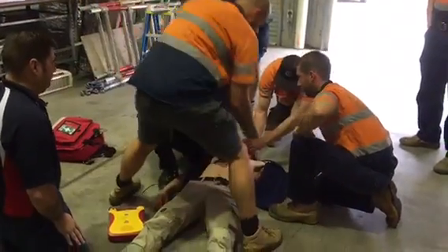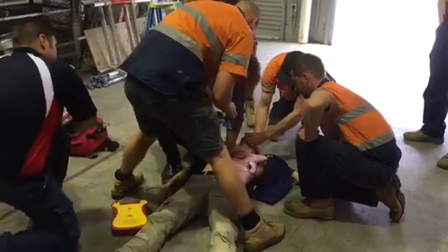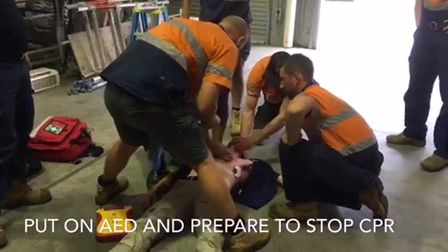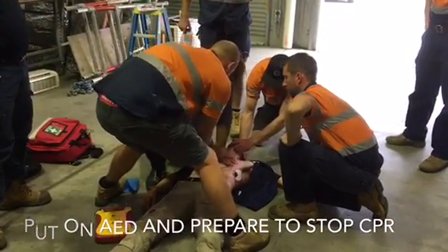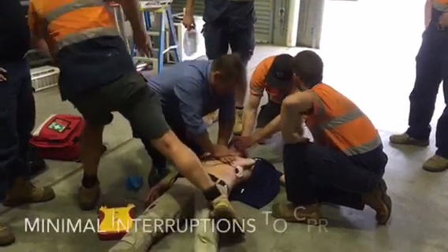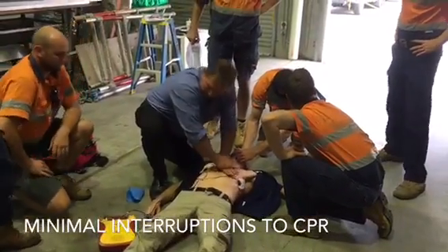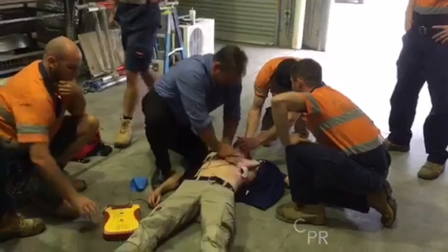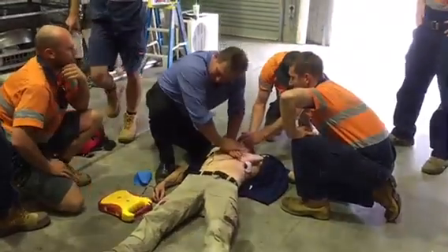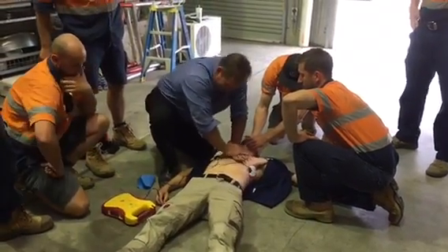Ready to get on. Pop that on your bumper, get it right up. Come in, mate. Help on the way. Come in, mate. Training mode.